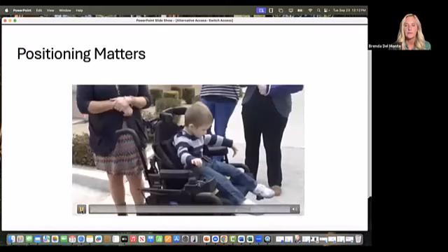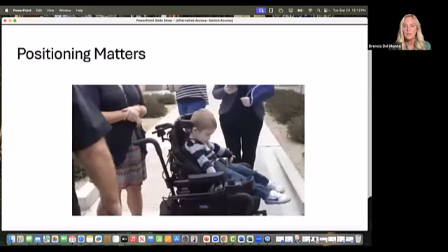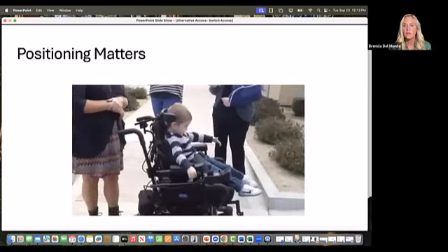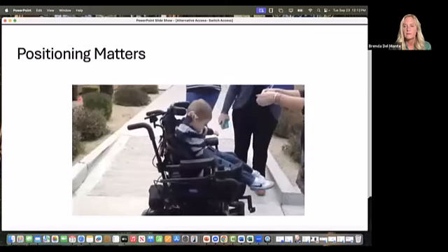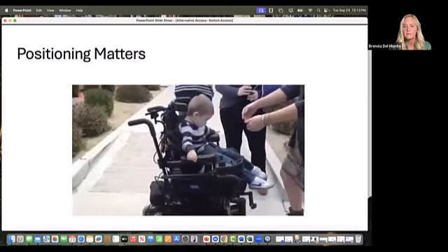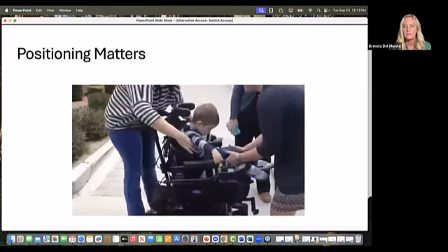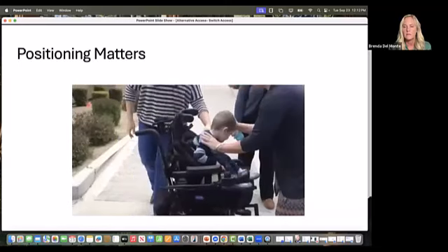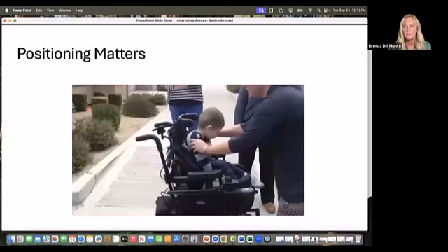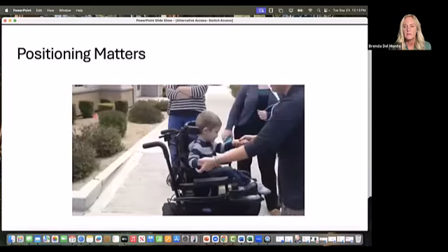Yeah. Where's he going? Okay. There you go. So he's trying to drive with his head control. See how he popped out a little bit? This is what he does. And so when he's not weight bearing on his butt, he's only going to have a little bit of head control. Yeah, okay, you're ready. Come on now. Can we find Papa now? Oh, other side. Hey, Camden, turn around.